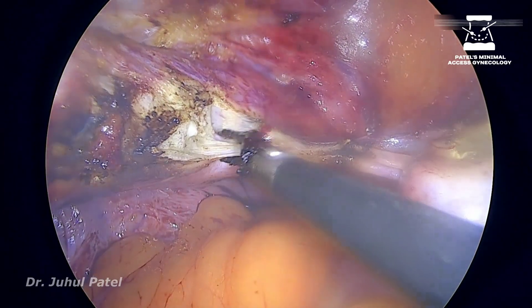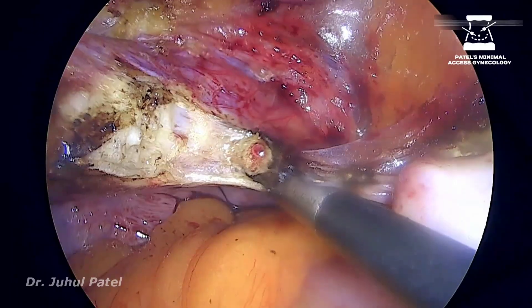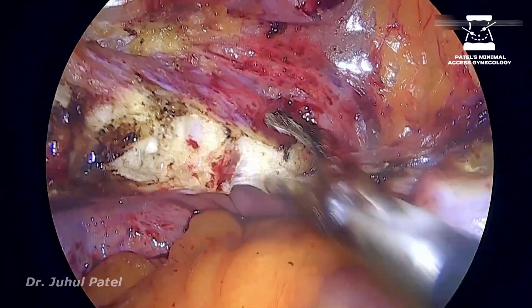Now once I see the lumen, I keep on chopping the tissue which is holding the lumen against the uterus. In that way, I can send the uterine down to the level of the colpotomizer.